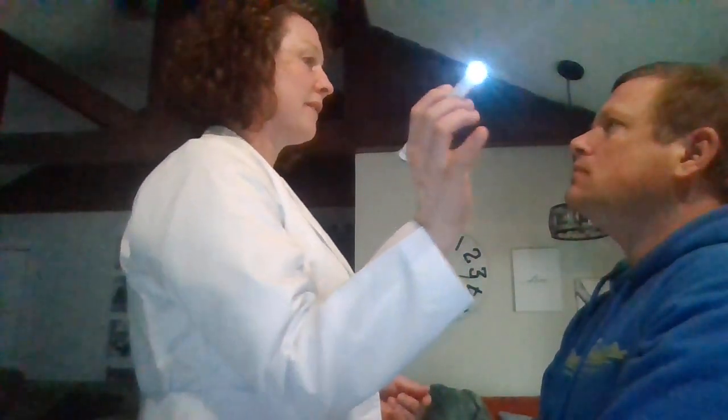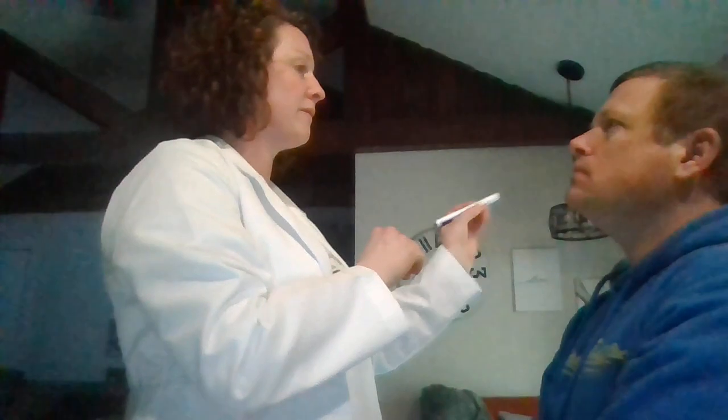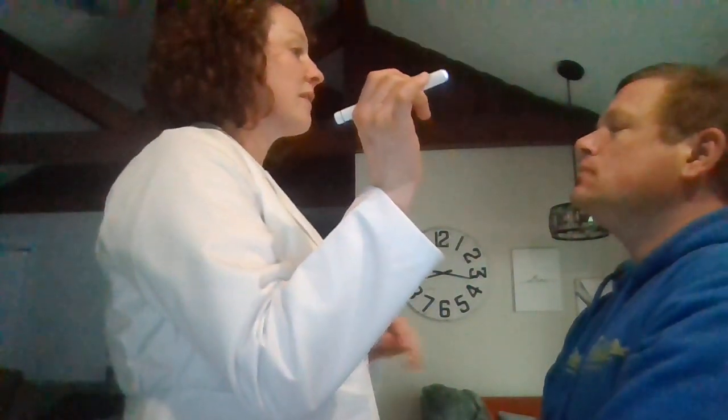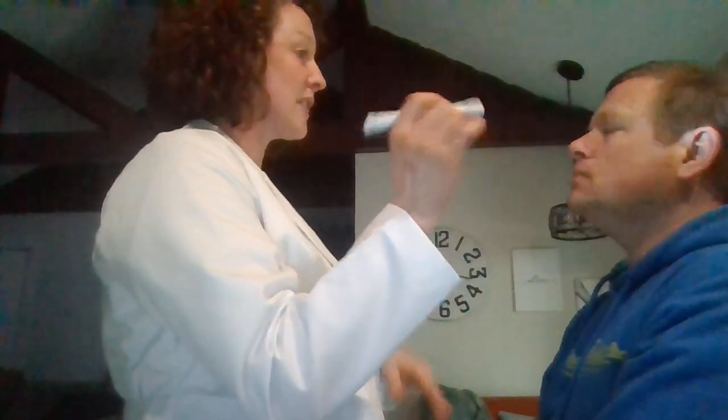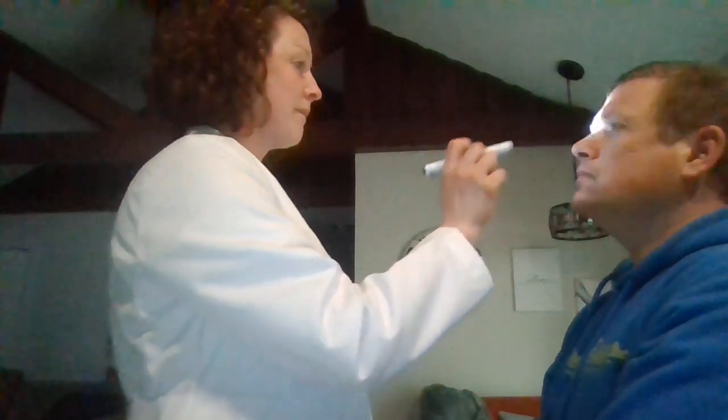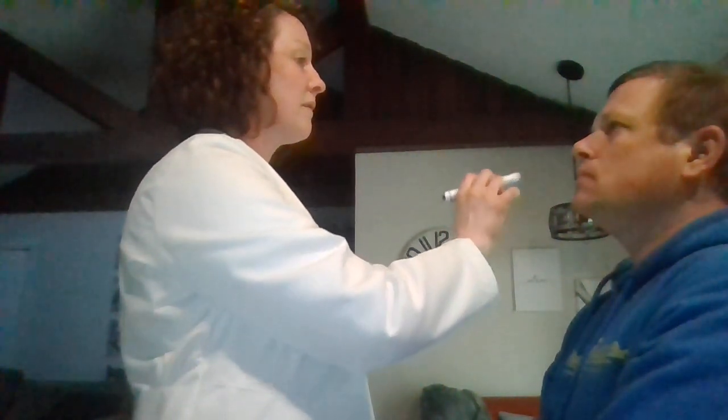Okay, now I'm going to turn off the light and check your pupillary reactions. I'm going to shine the light in your eye and see if your pupils are reactive. Very good. They are reactive and equal. Now I'm going to test to make sure that the other eye is reacting in the same way as I shine it on this side. So I'm going to shine it twice in this eye and then quickly over to the other eye. Okay, I'm going to do the same from this side. Okay, very good.